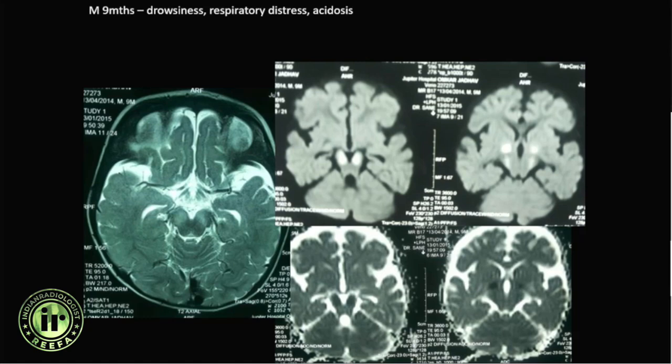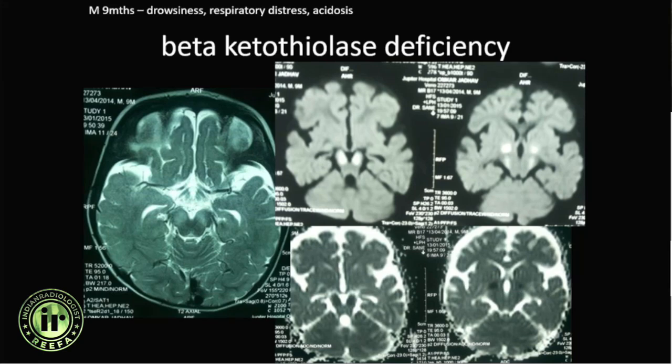The differential here was MSUD, but this turned out to be beta-ketothiolase deficiency.